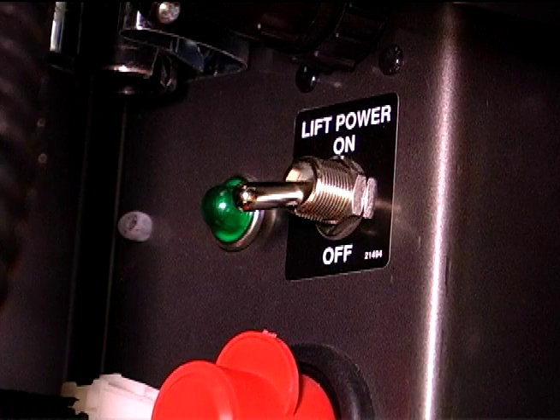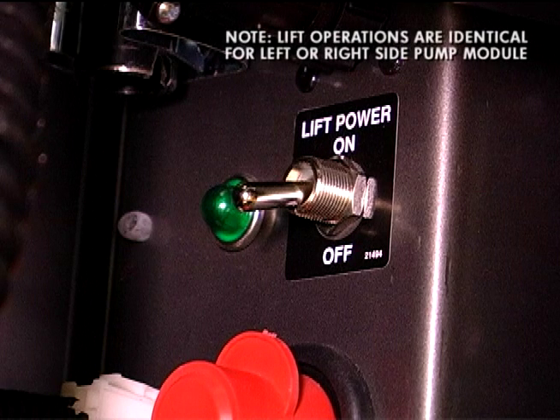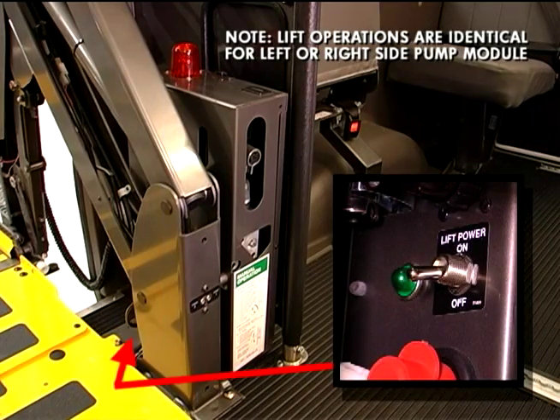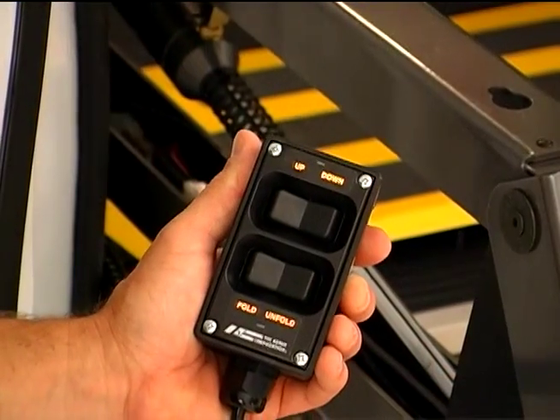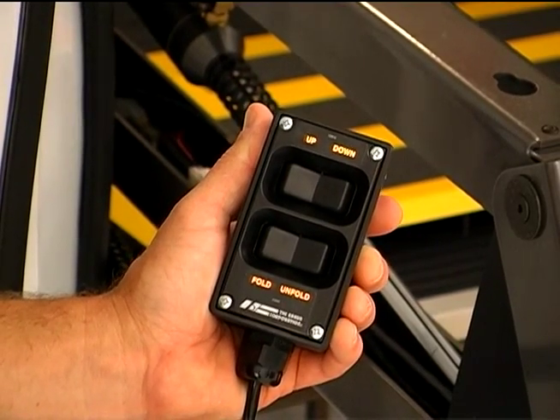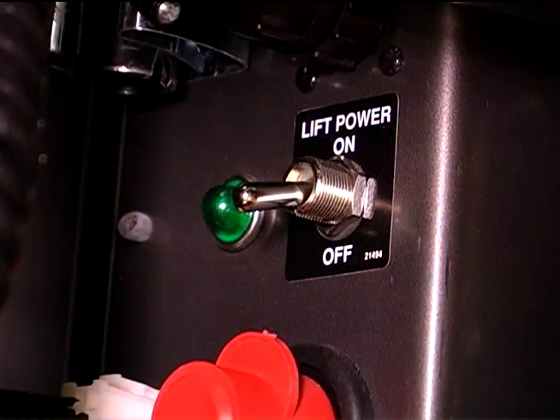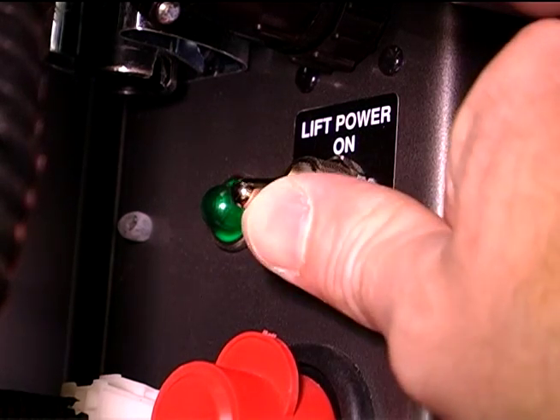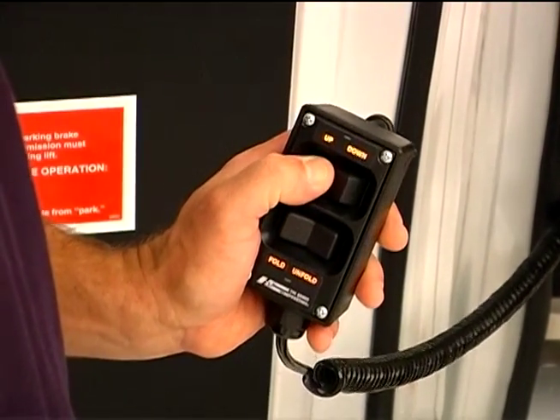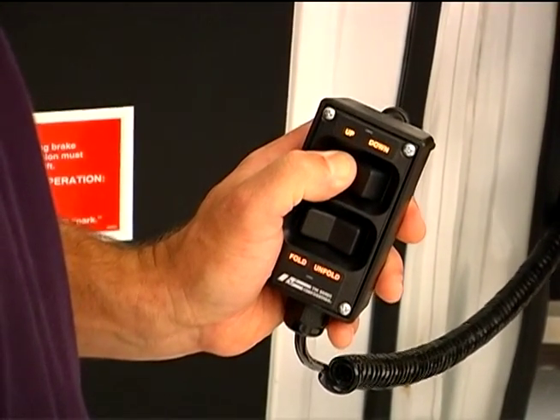All of the key functions of your Millennium Lift are easily and conveniently controlled using the on-off control switch mounted on the outboard face of the pump module, and the up-down and fold-unfold rocker switches on the Millennium Handheld Pendant Control. To operate the lift, check to be sure the on-off switch is in the on position, then simply use the handheld pendant to choose the appropriate functions.